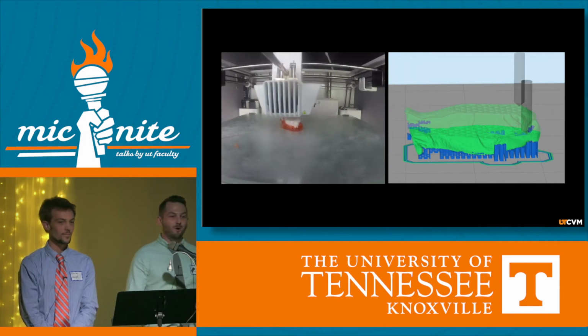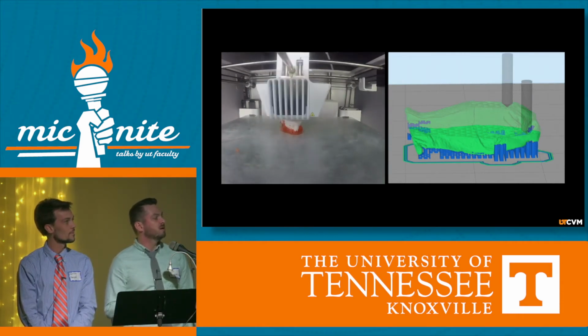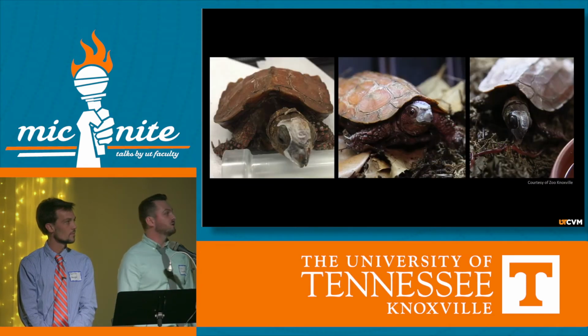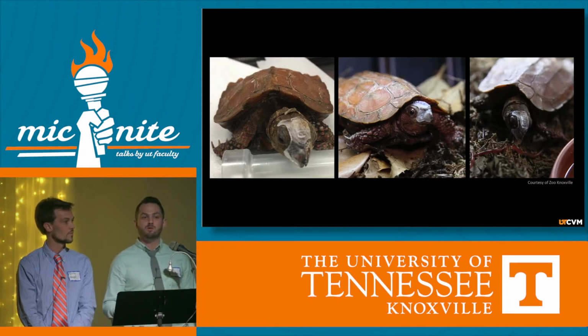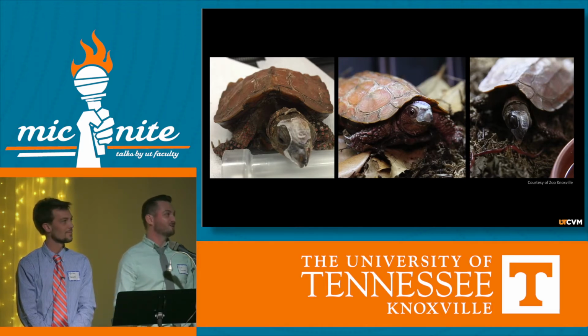So once we have our turtle face printed and we have our mask printed, which will be on a slightly different printer than this, we're going to get the turtle back into the hospital, give him a little bit of sedation, and we're going to see how it fits. So this first mask was designed just to stay on with a little bit of surgical glue, so it wasn't a long-term fix, but there's no reports of turtles in masks other than in TV, so we wanted to just see how he was going to do with this. And ultimately, he did very well. You can see him eating over here on the image to your right.